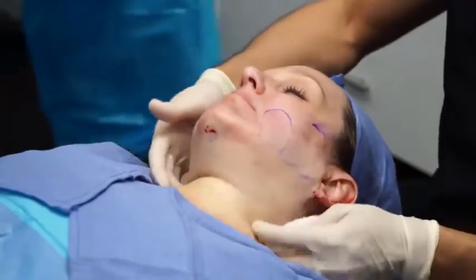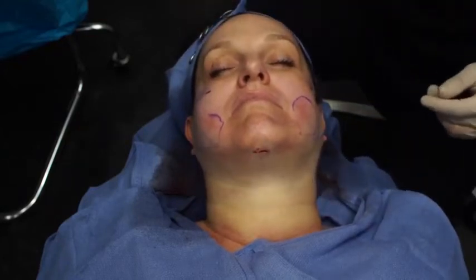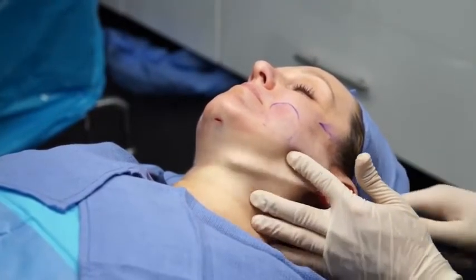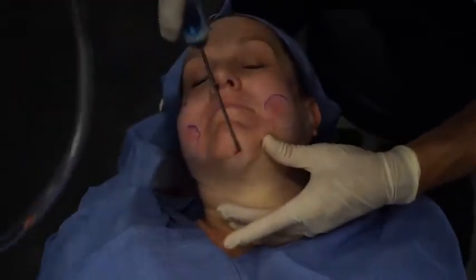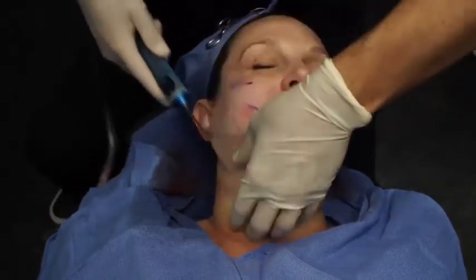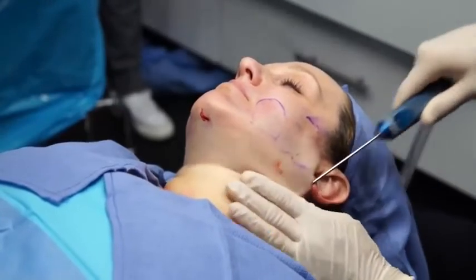So here we are. Our treatment looks pretty good. And chin way up for me. Now we're ready to aspirate a second time and remove any potential remaining fluid. So remember to aspirate any remaining fluid or fat that may cause an inflammatory response after the healing period. And here we are, a little bit after your treatment. While I'm down here, I'll get way down here to get some fat.